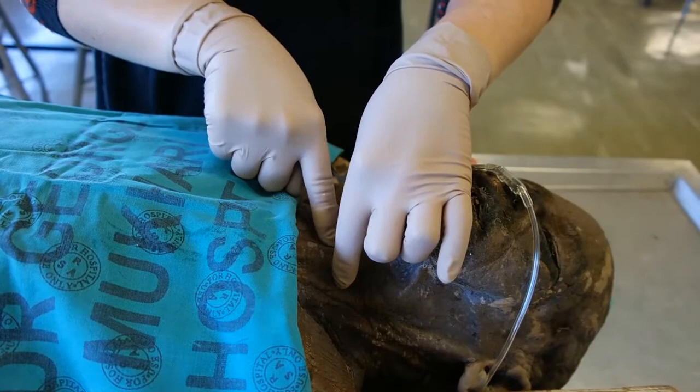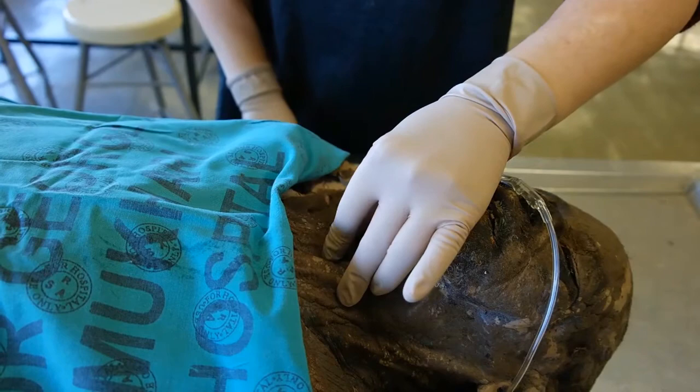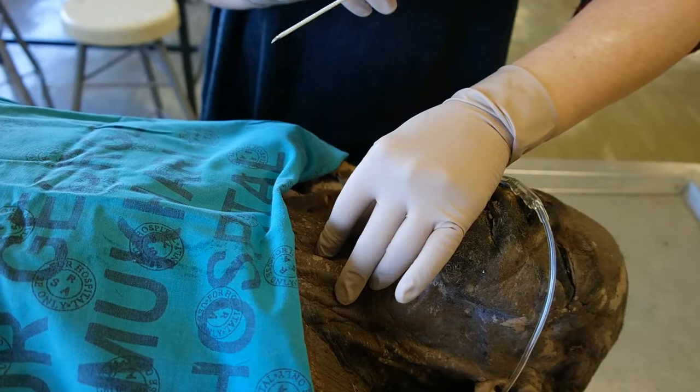Identify the anatomy by palpating the thyroid cartilage and sliding the finger down until a small depression is felt. Stabilise the thyroid cartilage between the thumb and middle finger of the non-dominant hand, using the index finger to palpate the membrane.